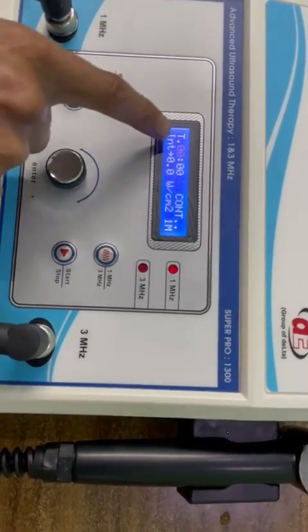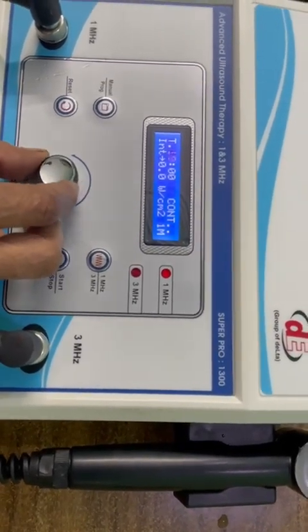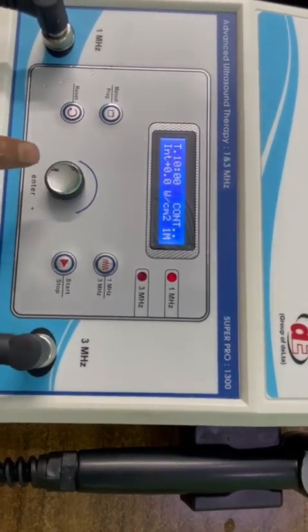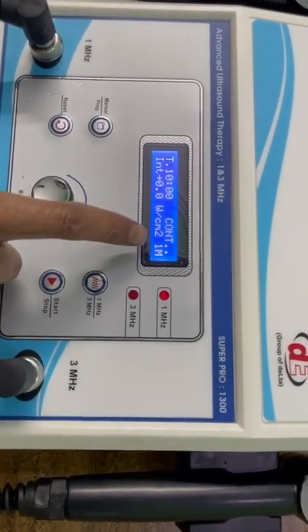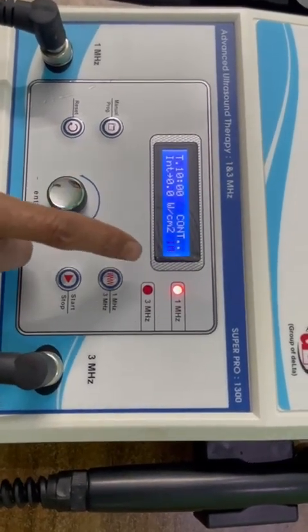Press it again. Set the time. You can rotate intensity mode. We set it at 10 minutes. Now press it again. Now continuous is blinking. Now we want to use it in continuous mode.